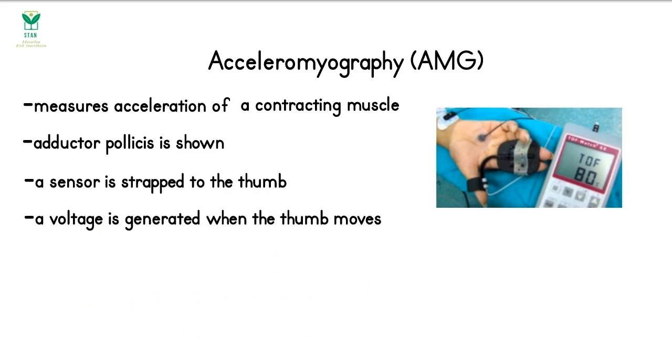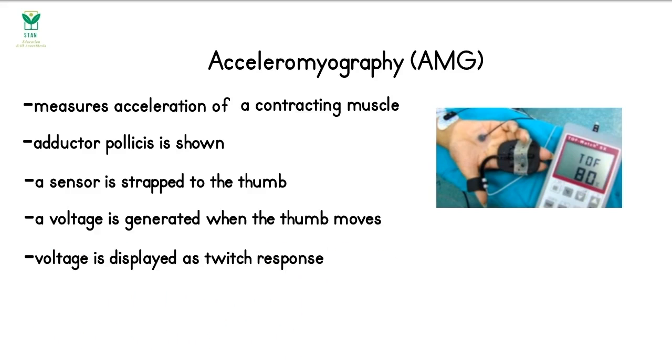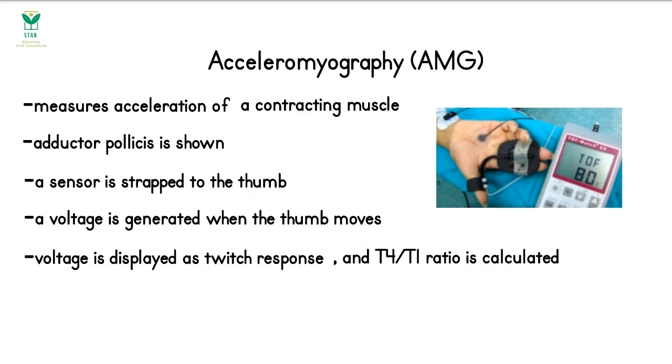This is then converted to an electrical signal, which is displayed as twitch response, and the T4 to T1 ratio can be calculated. The example shown in the picture is the train of 4 watch, or TOF Watch, made by Organon, and it's a commonly used acceleromyography device.